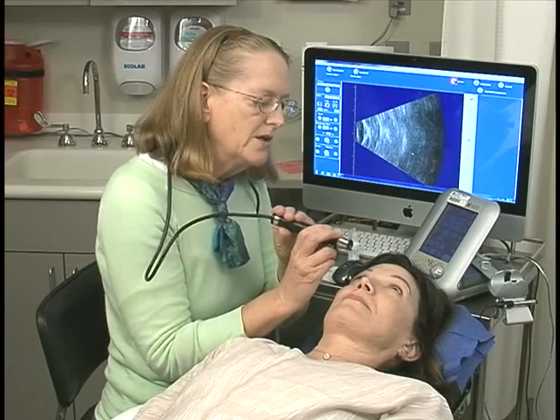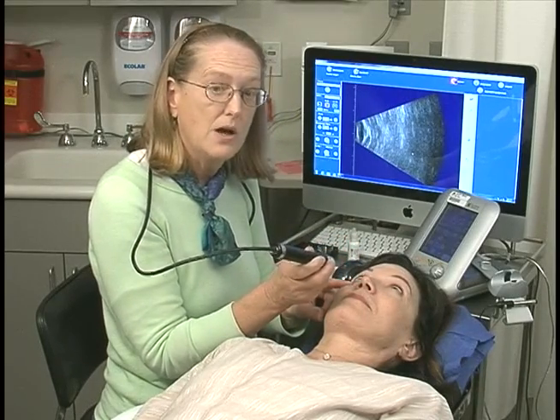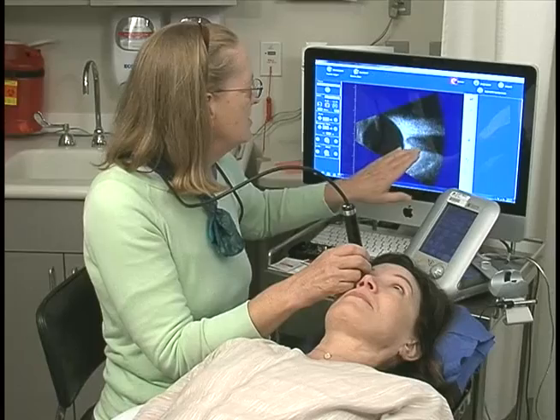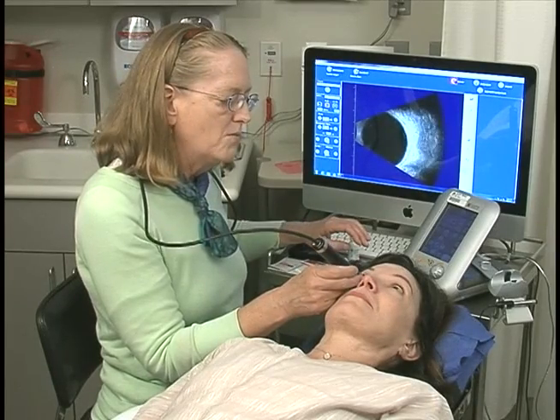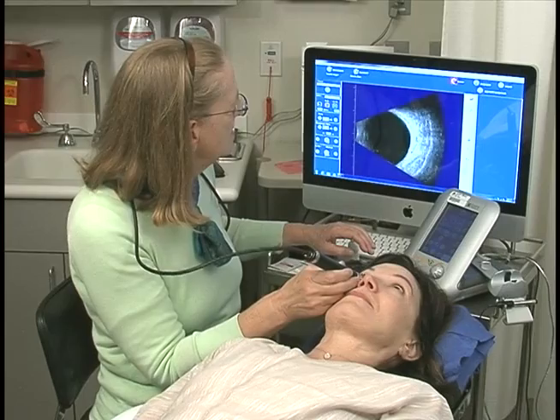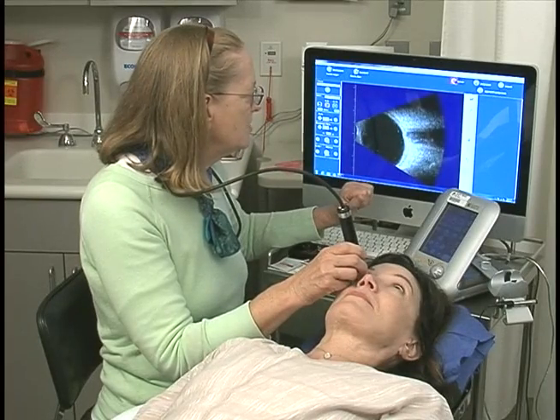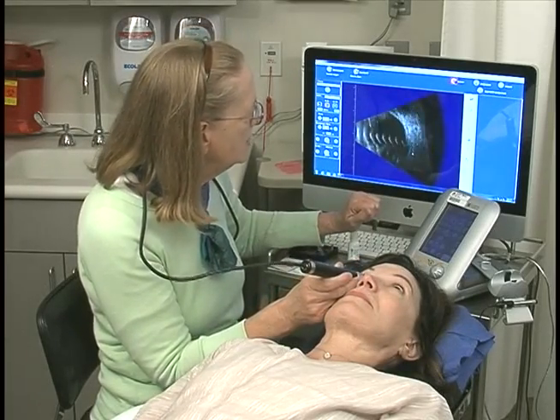Look way up high, please, with both eyes. The marker is placed nasally — you can touch it to make sure you're there. Make sure the patient is really looking at 12, not 11, 10, 1, or 2. I place the probe on the inferior limbus and go straight back towards the optic nerve — you can see the optic nerve shadow right here. Once I see the optic nerve shadow, I sweep the probe, and you see the sound beam moving up until I start to lose contact with the eye and see reverberations from the probe membrane. I've now examined the entire superior aspect from the optic nerve posteriorly, through the equatorial region, and way out to the superior periphery until we lose image quality.